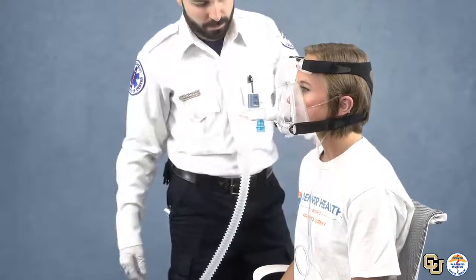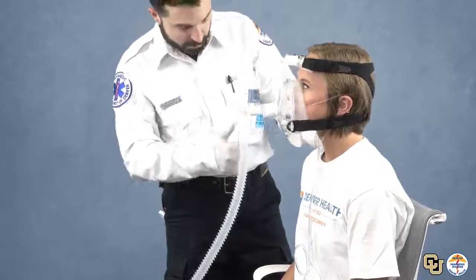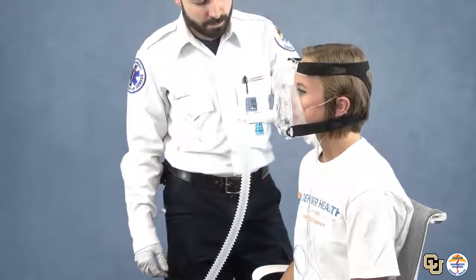Let's leave the mask on until we transfer care to a provider in a hospital or if the patient deteriorates. If our patient worsens or becomes unconscious, we need to remove the mask and assist with ventilations with a BVM and an airway adjunct like an NPA or OPA until a more advanced provider can maintain the patient's airway with an advanced airway, such as an endotracheal tube, or until you arrive at the emergency department.